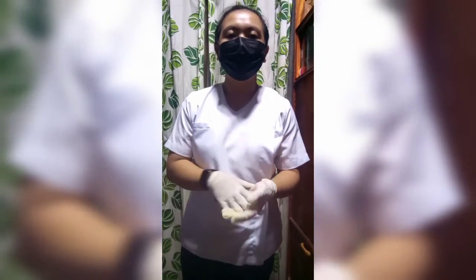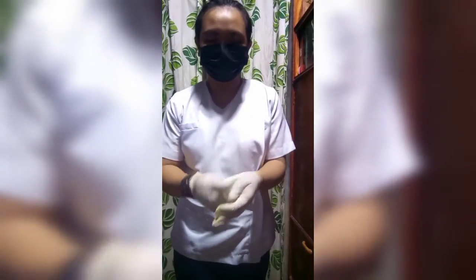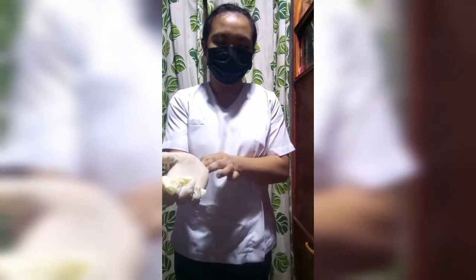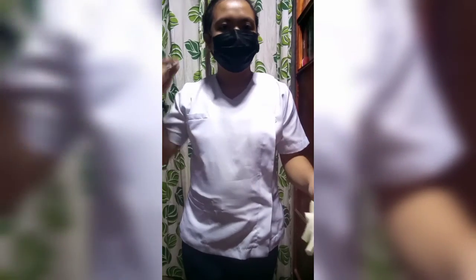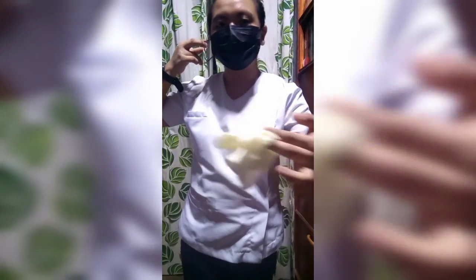After that, we need to remove our PPE if used and perform hand hygiene. In removing the gloves, insert two fingers and then roll, and then discard. Use the strings of the mask, and discard. Perform hand hygiene. After performing hand hygiene, put on clean gloves.